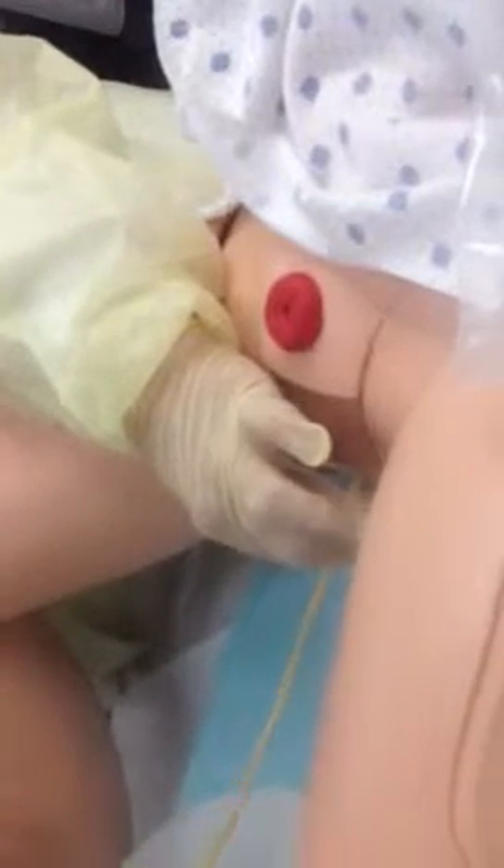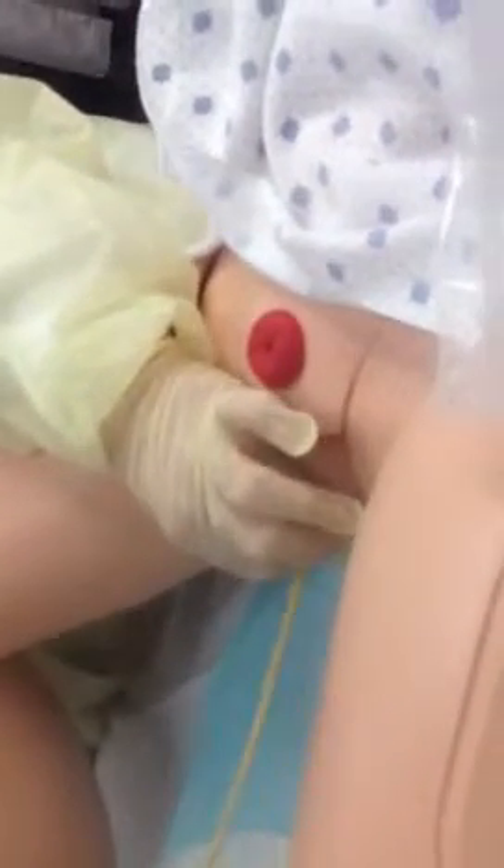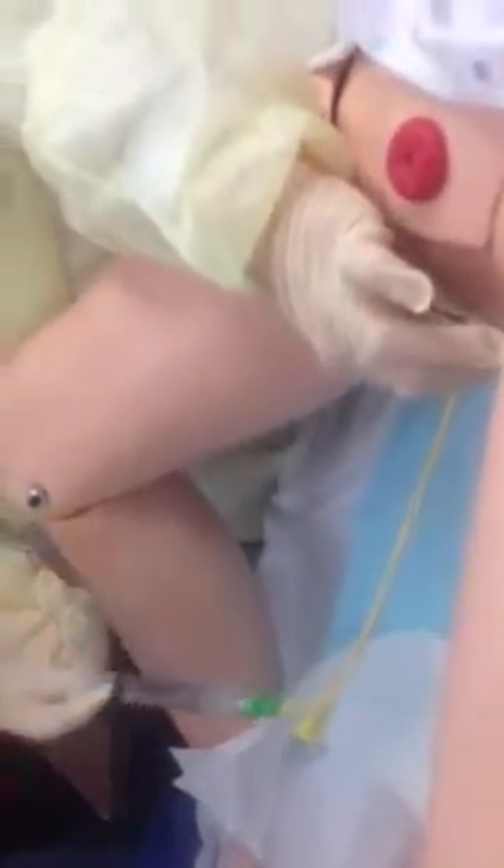It's in as far as it's going to go. You can put it all the way into the hub if you want to, up to the Y here. But you should get urine before that. Every body is different — the urethra may be longer than two to three inches. Once you get urine back in this tubing here, you want to insert it one more inch to make sure the balloon is inside the bladder and not in the urethra. At this point you would have already seen urine, then you can inflate your balloon. You just have to keep it pressed, and you can go ahead and touch this — it will stay in there.